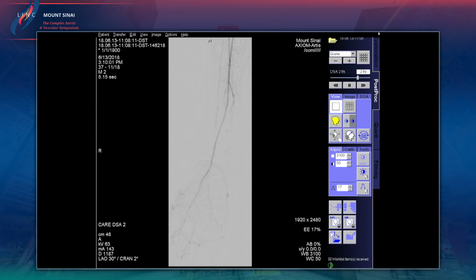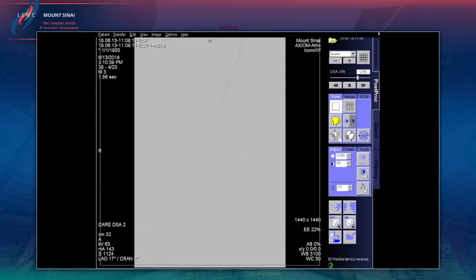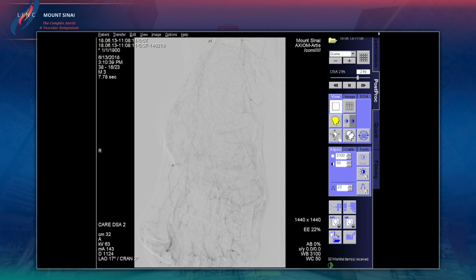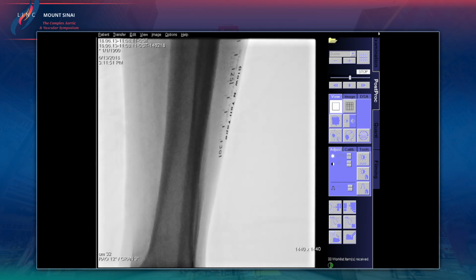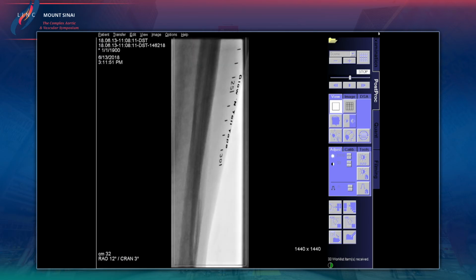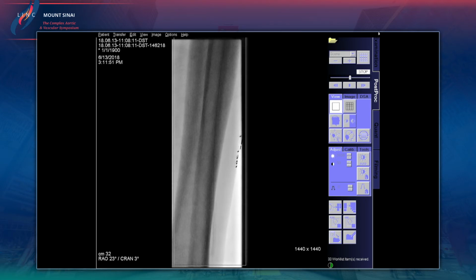Right distally around 30, that's what I'm a little worried about right there, Miguel. Yeah. But the flow into the foot looks really, really good. Oh. Wow, what a difference. Let me just try one other view here, just to look at that a little bit better. Shutter in, guys, for me. That would have been a great Perfusor case. Yeah, it would have been interesting to see.